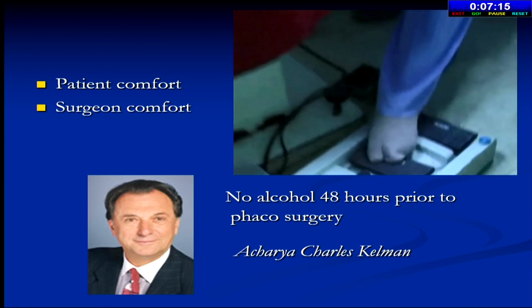Patient comfort and your comfort are very important before starting any surgery. Check your pedals, check your IPD, check everything. No palpitation before starting surgery. In Phaco, if palpitation starts beforehand, then you will break down, you will fall. So make sure you are focused, your seat, your height. When you sit there, you should not then say, call me, take me up, take me down. Before you start with the patient, make sure your eye, your brain, your focus, your deep breathing are comfortable.